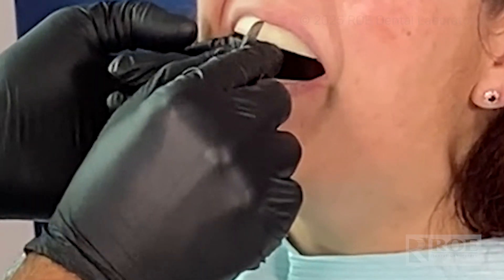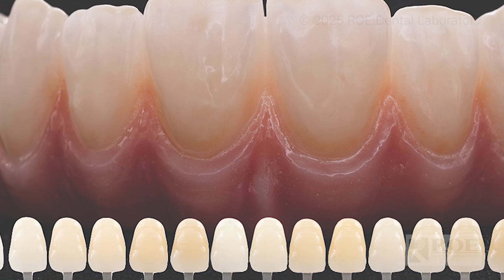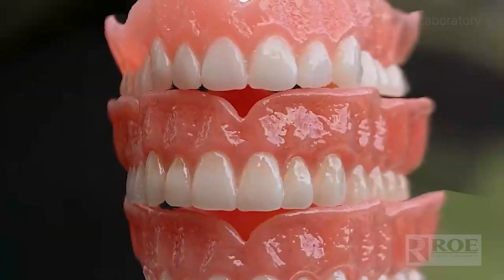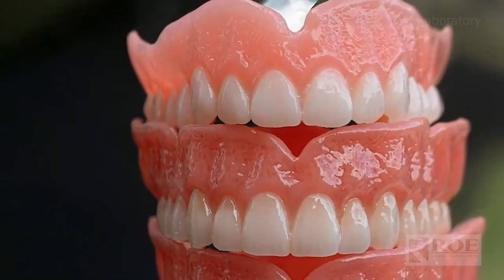If you're not satisfied with your final digital denture for whatever reason, we can then complete a reverse reset on your digital denture. What that means is you make the necessary changes and markings to that denture, whether it's midline, adjusting the bite, or simply ordering a new shade — send that into Roe and order a reverse reset.